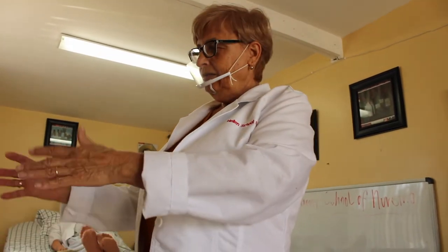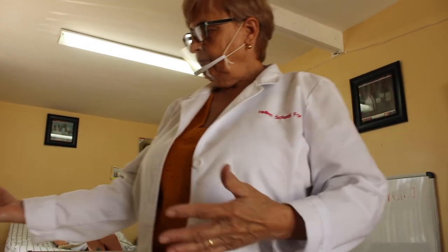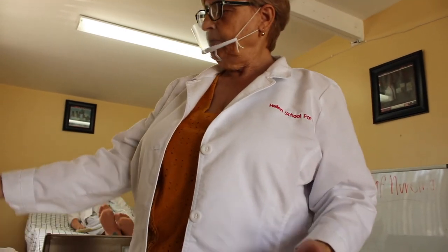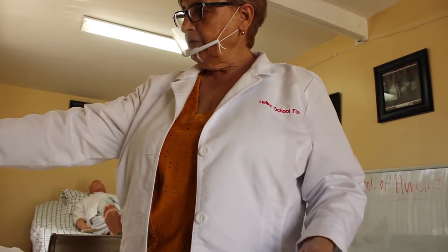For the state exam, this is one of the state exam tests. Sometimes they put water, not urine, in a bedpan and they ask you to put the urine from the bedpan inside the measured container.